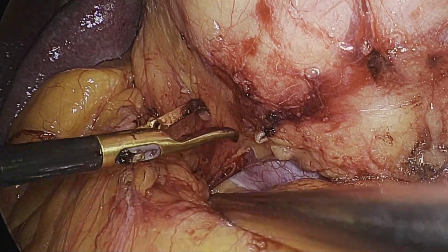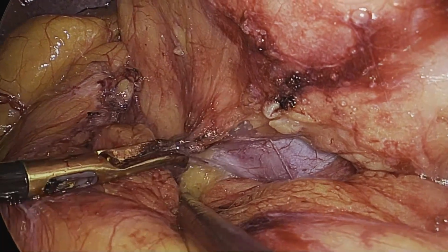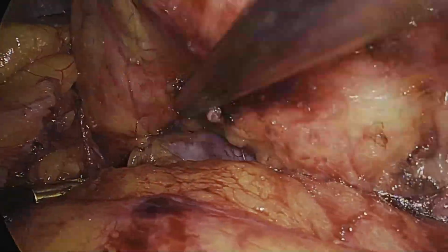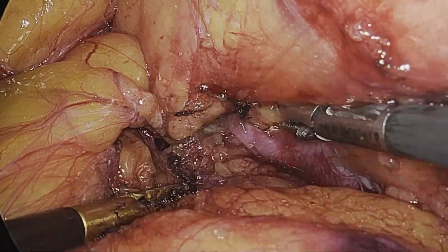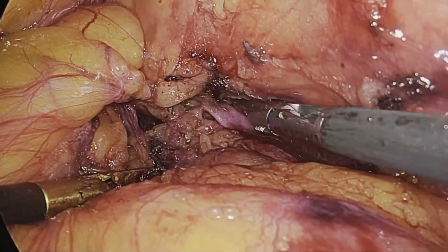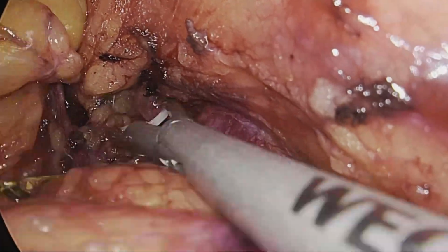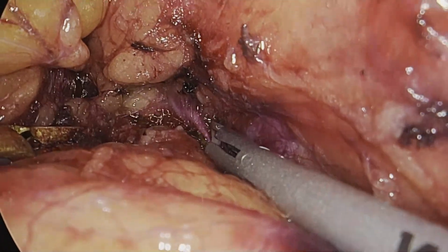This vein above the renal vein, which is draining into it, is the adrenal vein. So we'll first handle the adrenal vein and then go ahead with the dissection. So, a right angle instrument is being inserted, and the adrenal vein is being dissected from behind so that it can be clipped. Now, two clips will be placed, one towards the patient side and one towards the adrenal side, so that it can be cut in between.